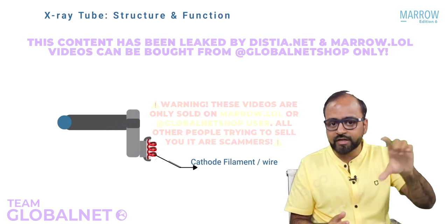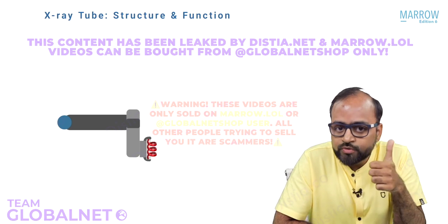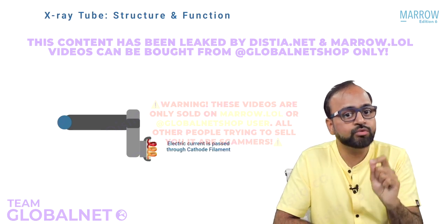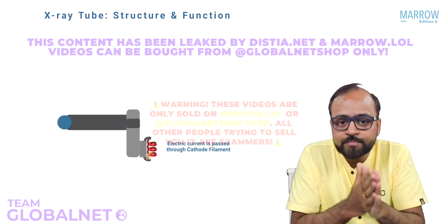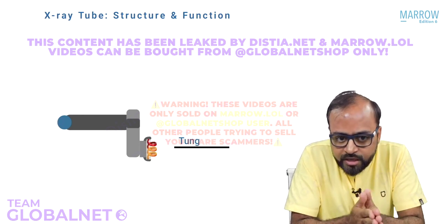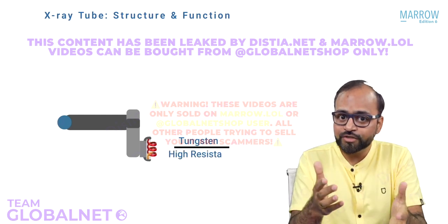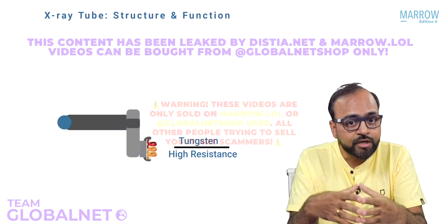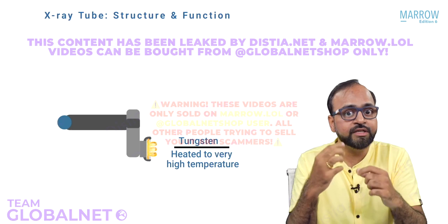Now a small circuit is attached across this tungsten filament or cathode filament, and when you switch on the X-ray tube, what happens? A small electric current is being passed through this particular cathode filament. Can you see the electric current there? So electric current is passing through this filament. So what is going to happen? Once an electric current is passed through it, remember tungsten is a very heavy metal, so it has a very high resistance to the conduction of electricity. So what is going to happen? Because of this high resistance to the conduction of electricity, this tungsten filament is going to get heated.